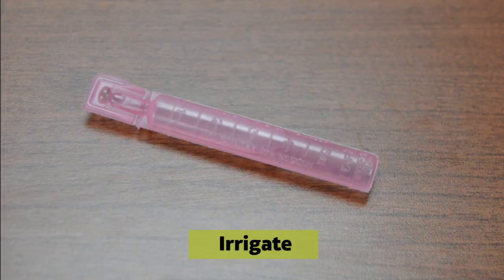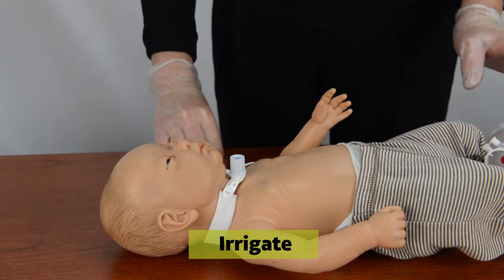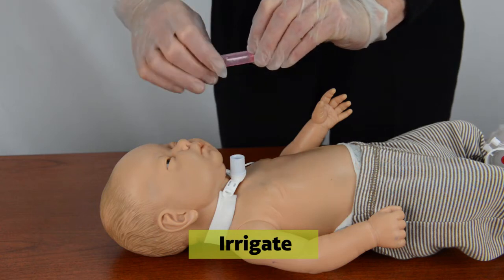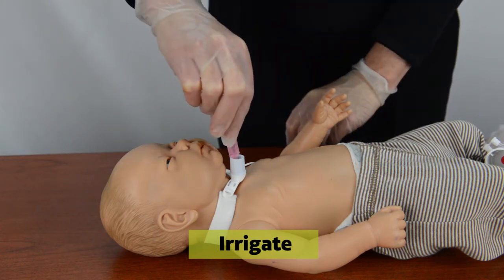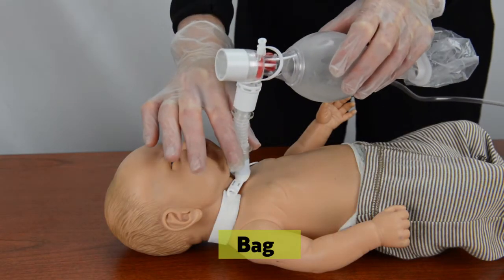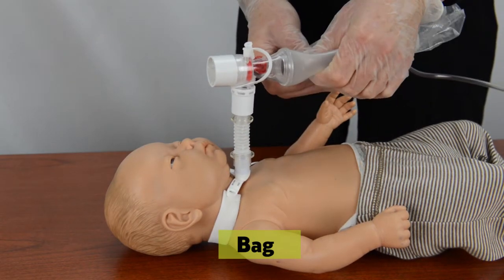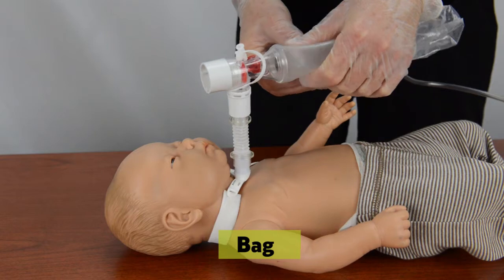I is for irrigate, which means putting saline into the trach. Remove the resuscitation bag from the trach tube. Take a pink saline tube and squeeze about one or two milliliters into the trach. B is for bag, which means use the resuscitation bag again. Squeeze the bag firmly and repeatedly about five times.